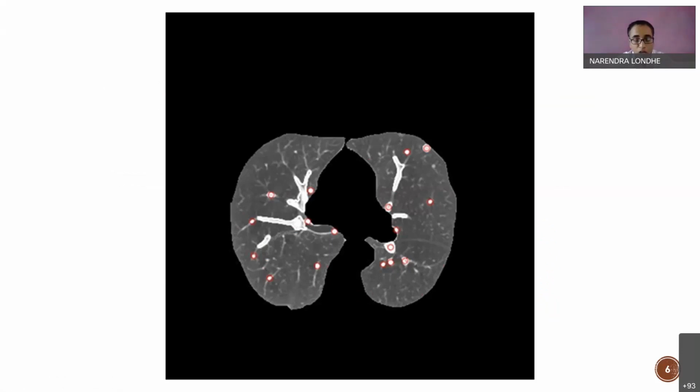You have to find the abnormal objects in your images. To find the abnormality, you may first need to segment the organ, and then find the abnormality in that organ. It is part of the process, so you have to understand the problem and do the segmentation of your medical images accordingly.